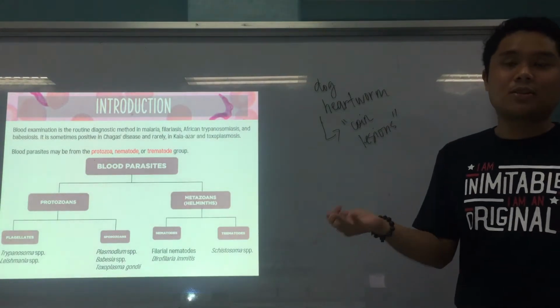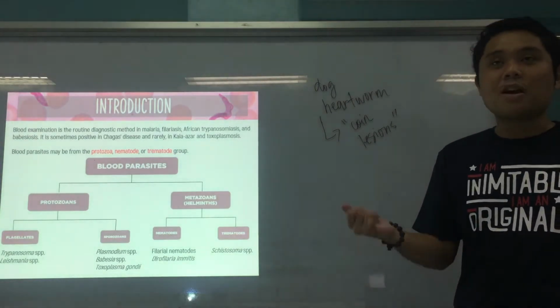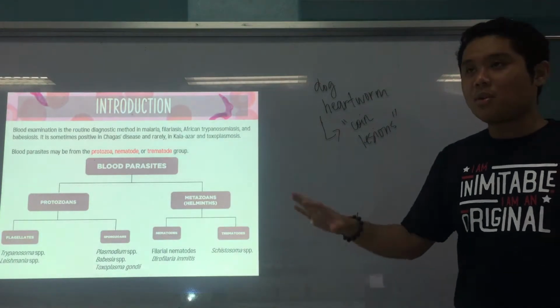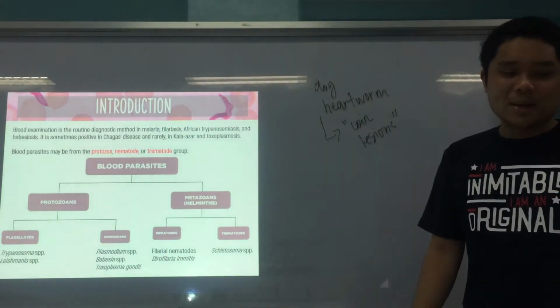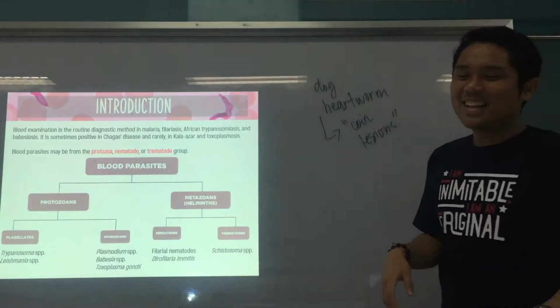in urine, right? So in stool, you have Schistosoma mansoni and Schistosoma japonicum. For urine, it is Schistosoma haematobium. That's why we will not be discussing Schistosoma here because we're already done with that, okay?